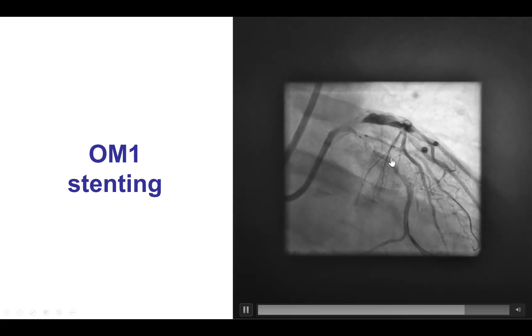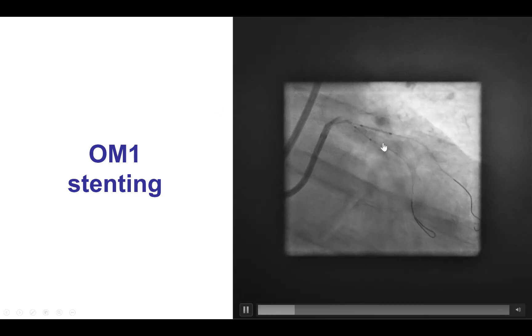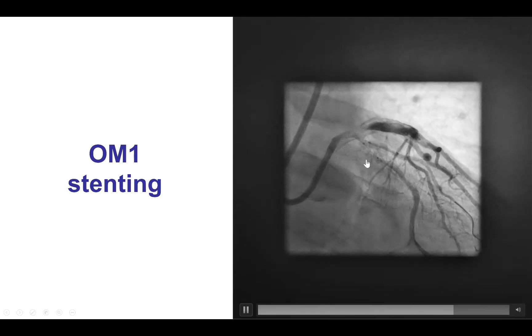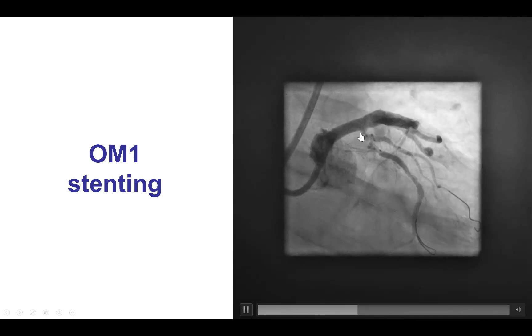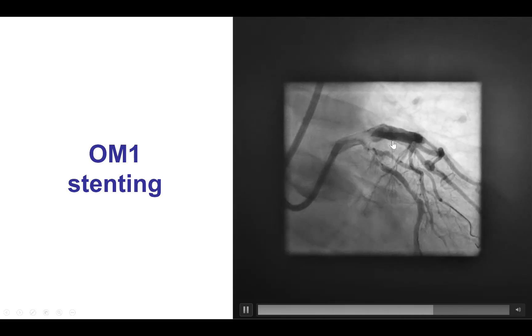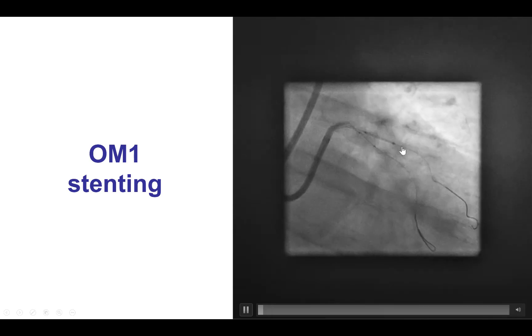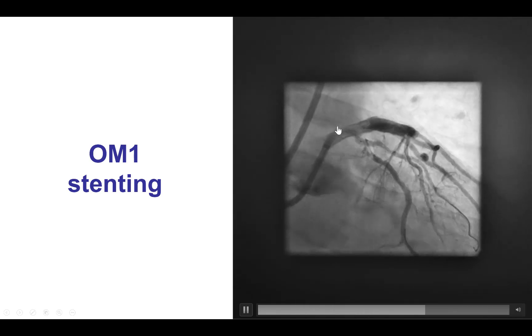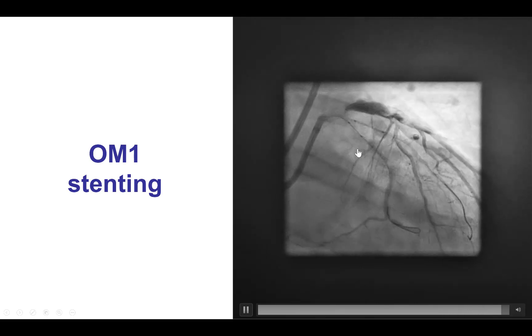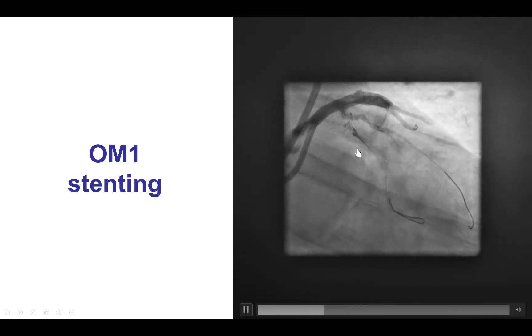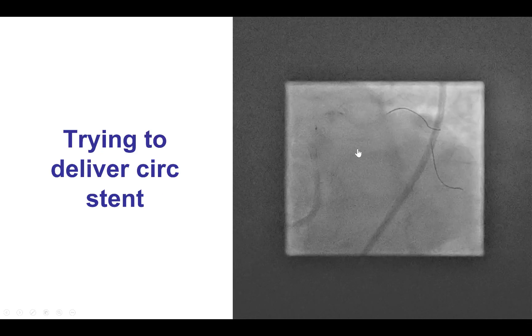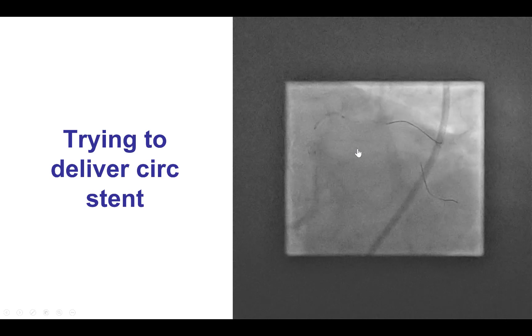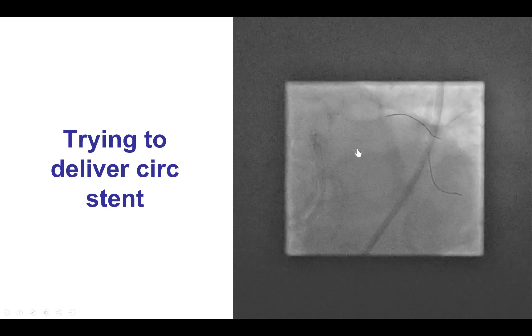This is the stent into the obtuse marginal branch. We did have a balloon into the main vessel in the circumflex, in case the OM stent went further back than anticipated. But actually, we were fortunate in that the stent did not move.